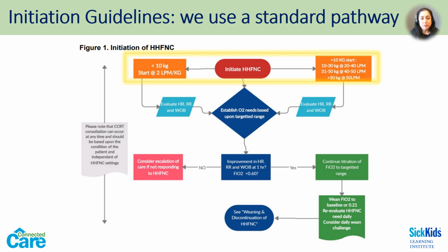One thing to remember is that the 2 liter per minute approach is really for those infants, and that stems from some of the research in bronchiolitis and the use of high flow nasal cannulas on the wards. It is safe to use 2 per kilo, and we've actually moved away from titrating flow rates in this population altogether and approaching it as a 2 per kilo strategy.